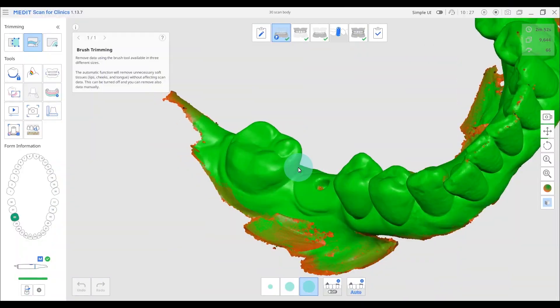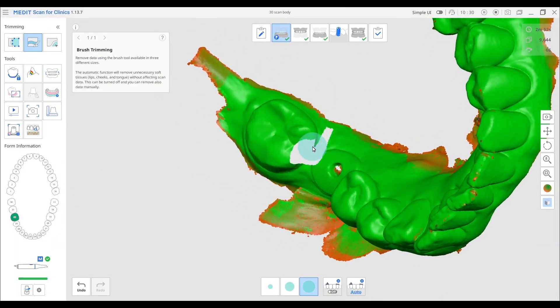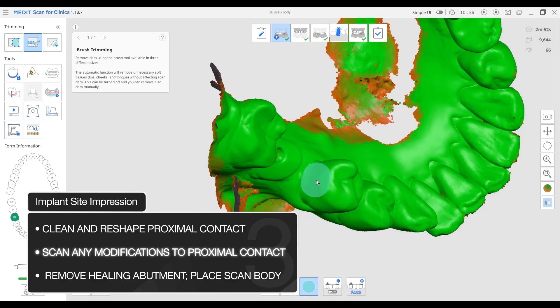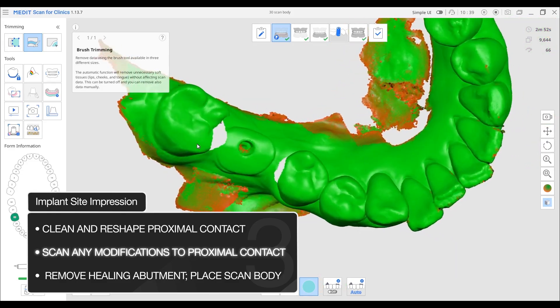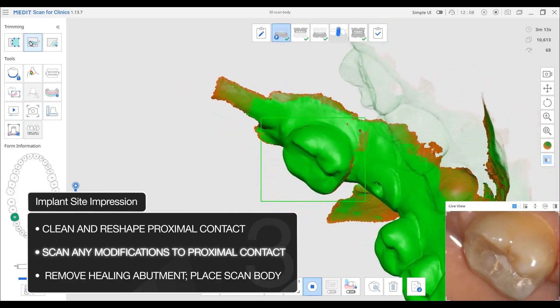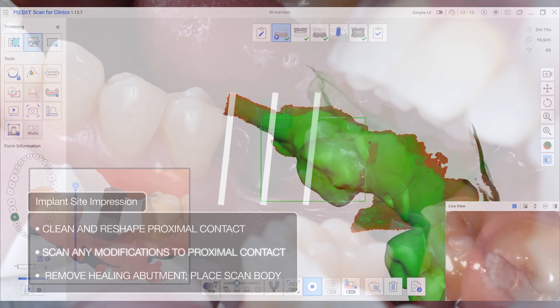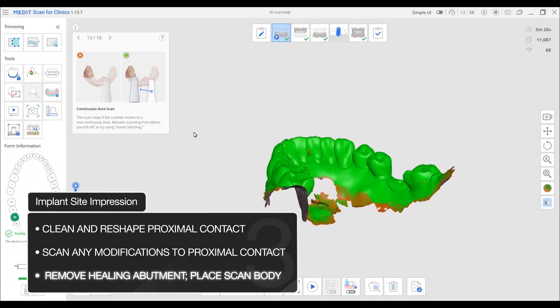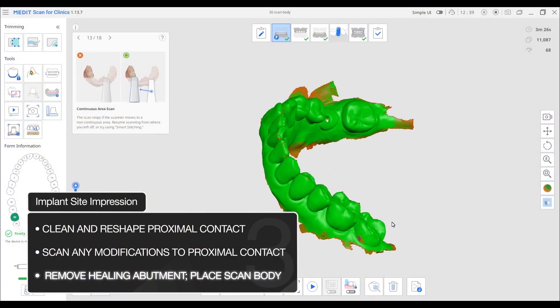Assessment of the path of draw and contact points can be done by looking at the scan. If any modifications to these contact areas were made, the scan can easily be modified to accommodate these changes. Changes might be made to get a better path of draw or increase the surface area of the contact.